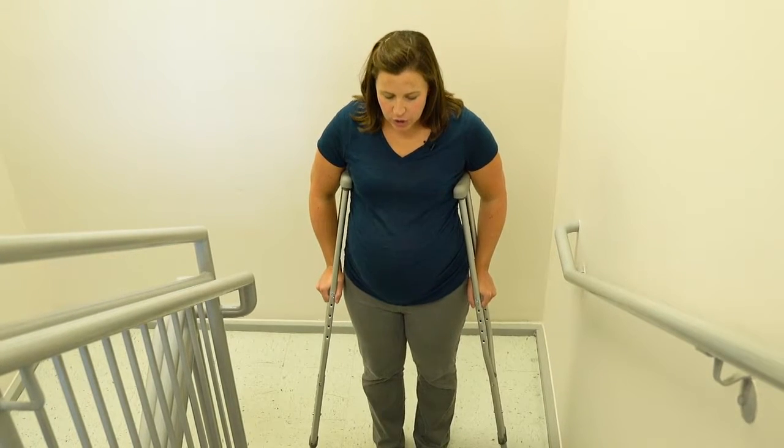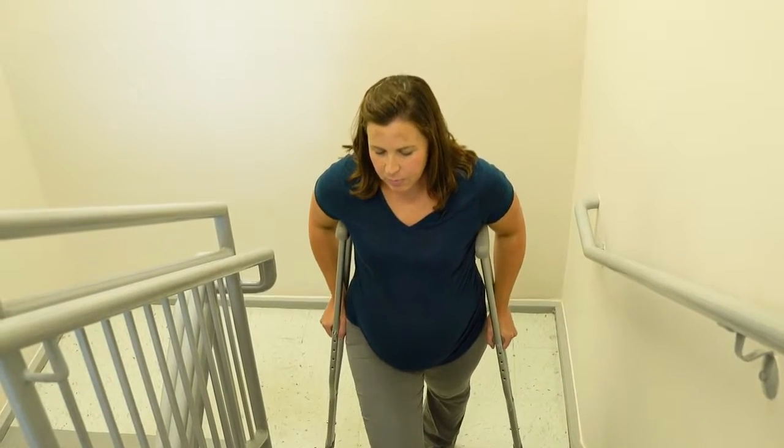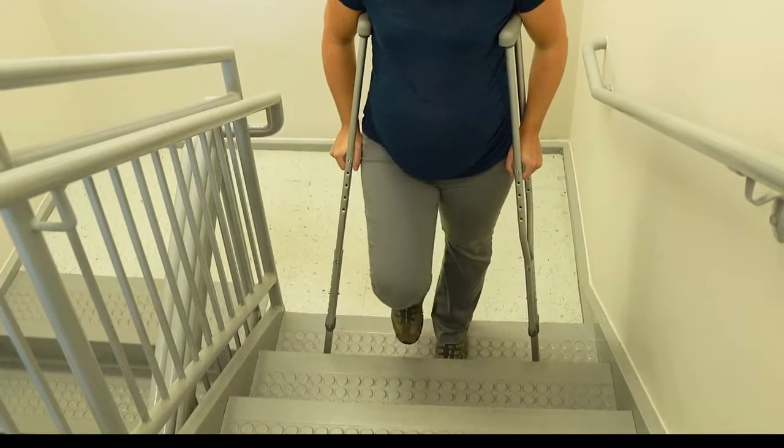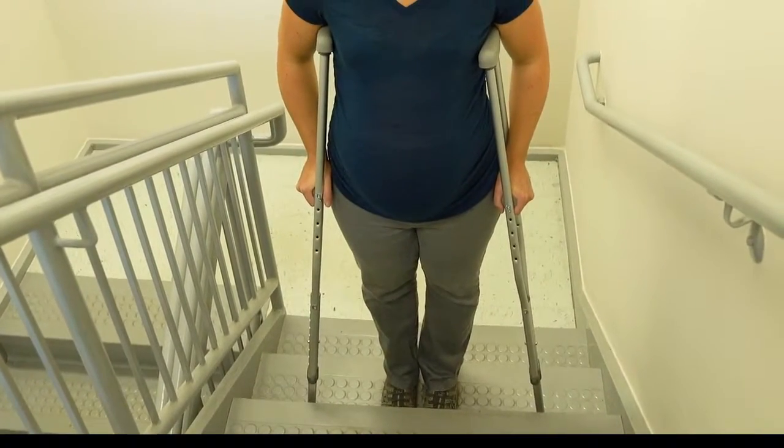If you do not have a set of railings to use, you are going to step up with your good or unaffected leg, push through that leg, and then bring your affected leg and the crutches up with you. Good foot up, and then the affected leg and crutches follow behind.